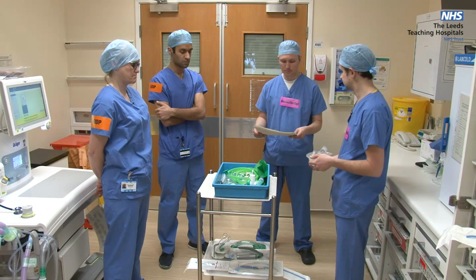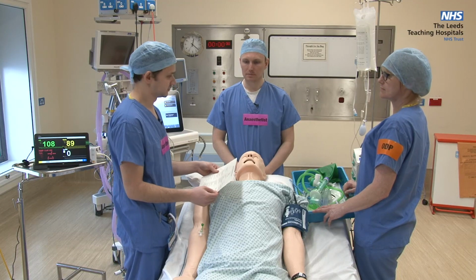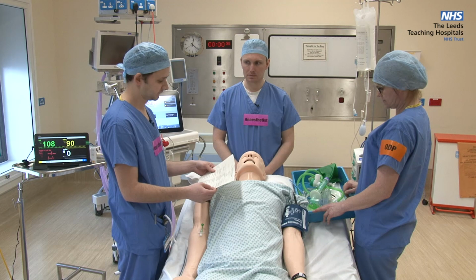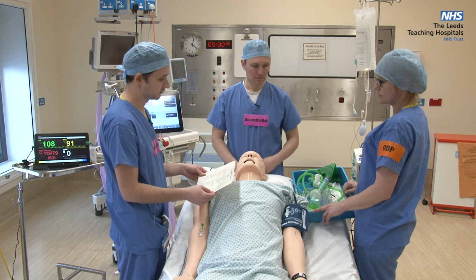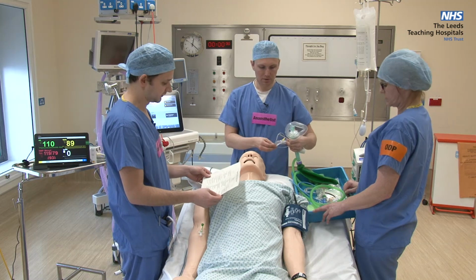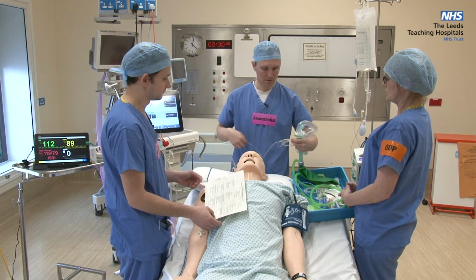No. Thank you. We are now inside the patient's room and we are preparing to intubate the patient, and we will do the checklist before doing that procedure. We will apply the monitoring if it's not already been done, including a SATS probe, the ECG monitoring and non-invasive blood pressure and capnography. The intubator will begin pre-oxygenation with the APL valve closed, and we'll optimise the patient's position.